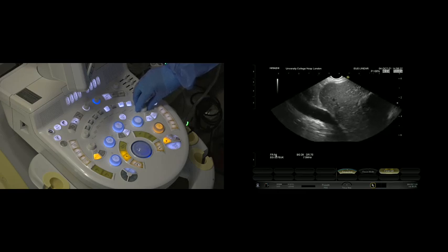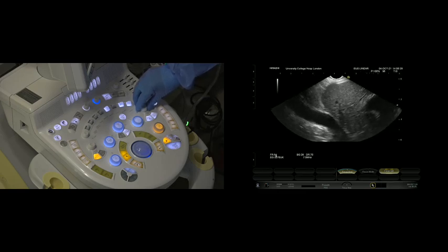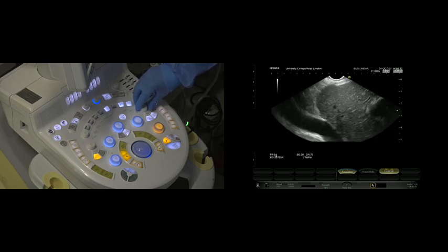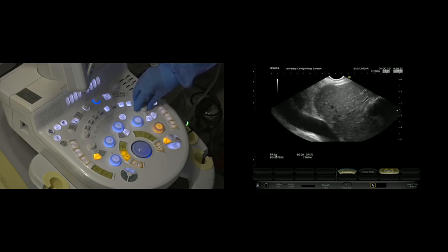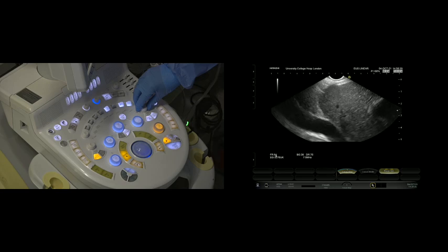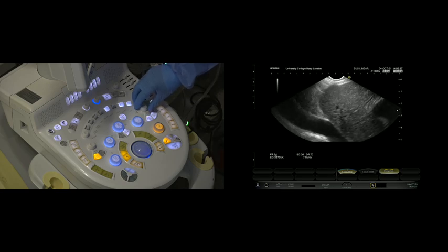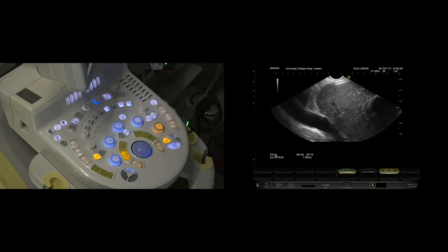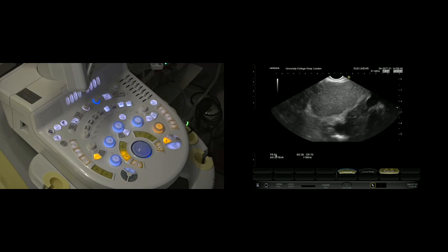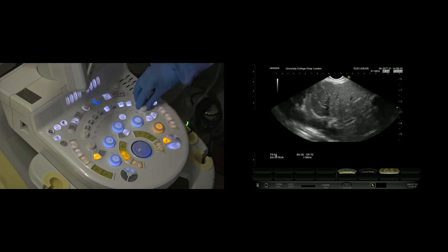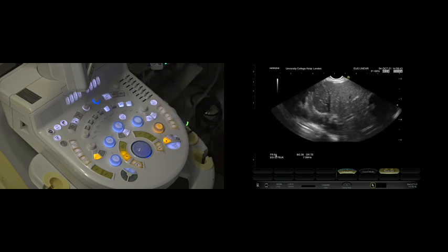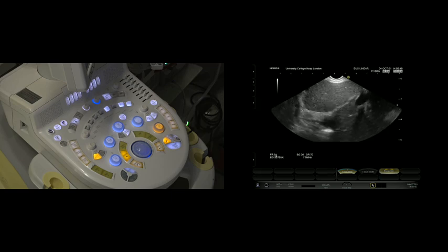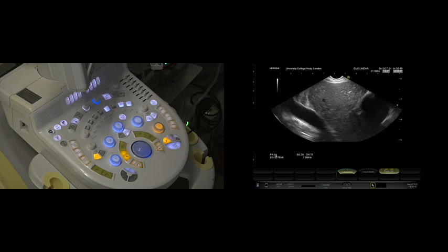For a decent diagnostic pancreatic scan, you might want that at about five, maybe six. If you're looking at the depth of the liver for metastases, you'd want that to be magged out, or if you're struggling to find a gallbladder anatomically, you want that to be giving you a bigger field of view with the depth dialed right out.